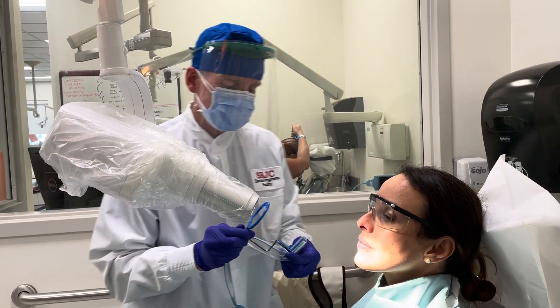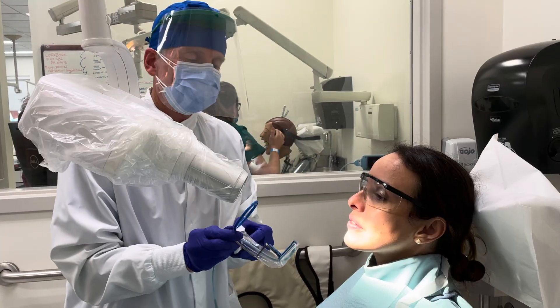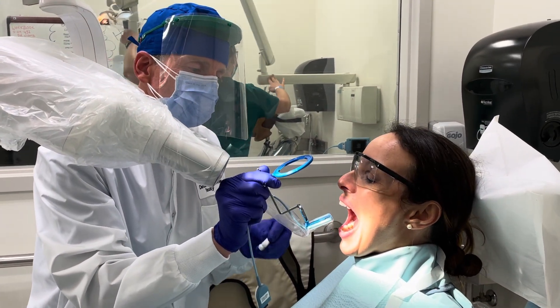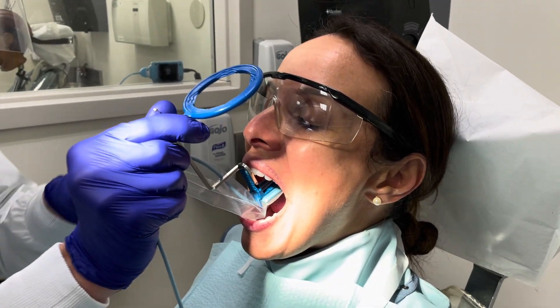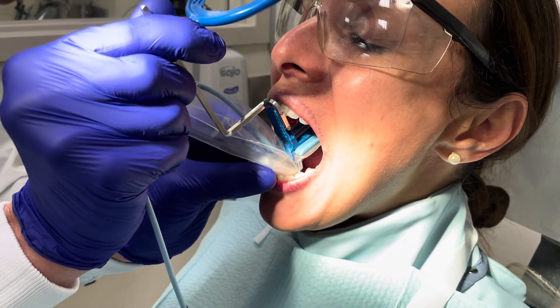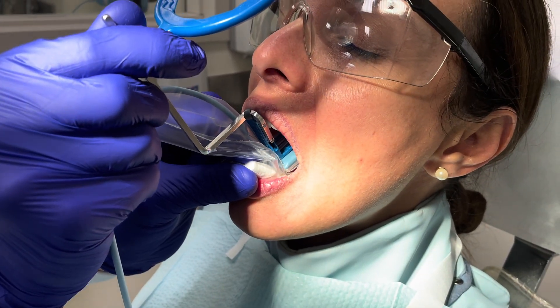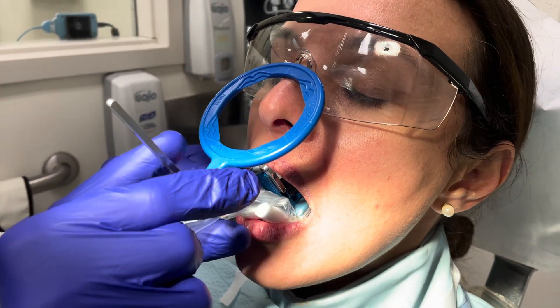Again, anterior SCP, maxillary centrals. Open please. We're going to bring in the sensor horizontal to the occlusal plane, touching the teeth of interest pretty close to the very end of the bite block. For her we need two cotton rolls. I'm going to place these in place. Maria, slightly bite down, not too hard. Good, and slide that against her nose. Great.